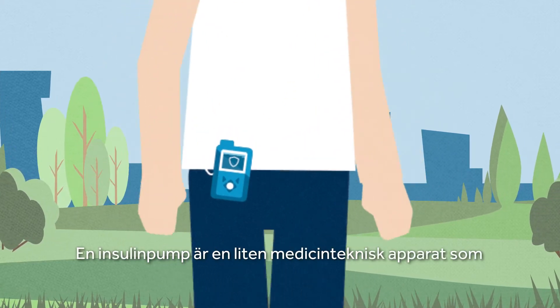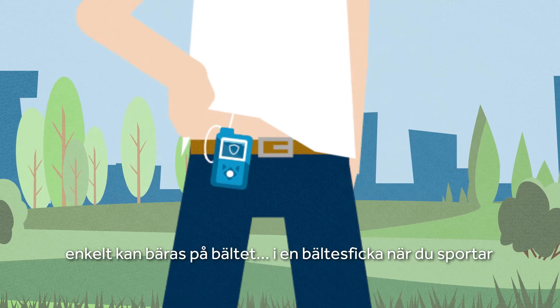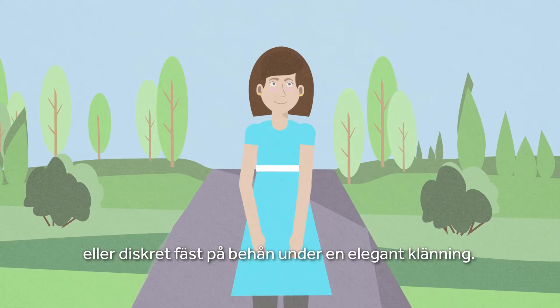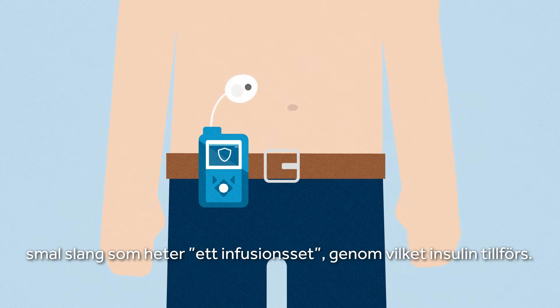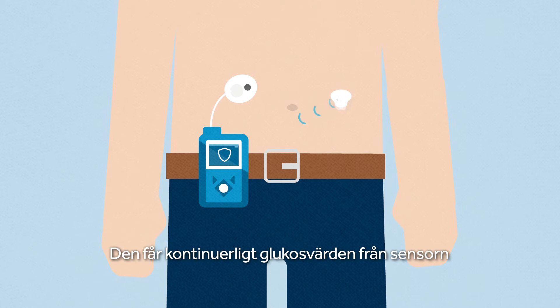An insulin pump is a small electronic device that can easily be worn on a belt, in a belt pouch while playing sports, or discreetly attached to a bra under an elegant dress. The device is connected to your body via a thin tube called an infusion set through which insulin is delivered. It also receives continuous glucose monitoring data from the sensor.